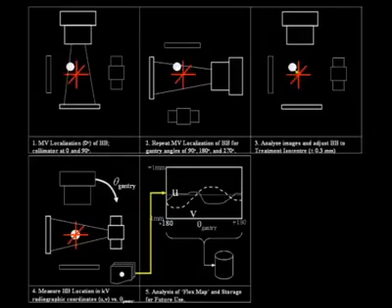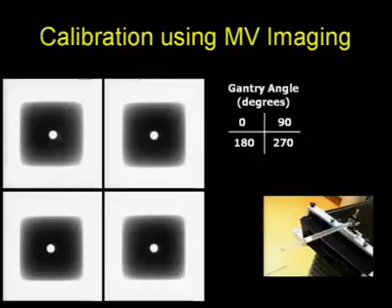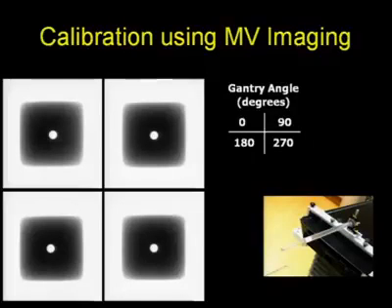And these calibration flex maps are then recorded onto the hard disk of the system and are subsequently used to correct clinical projections and ensure calibration, that the relationship that I talked about between the MV and image guidance system isocenters is known and corrected for. So again, this is a cartoon showing images obtained for cone beam CT calibration.